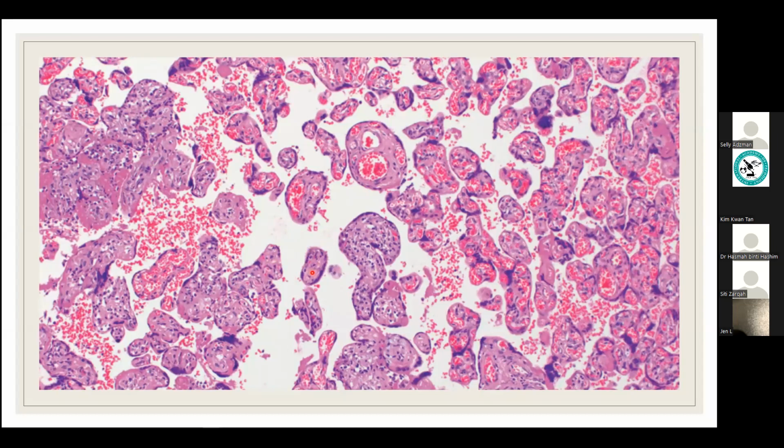But the problem is when we receive fragmented tissue and find only 1 focus, since it was sent in fragments. If there is 1 focus of, say, 15 villi of chronic villitis, it is suspicious of high-grade villitis. Then we need to correlate with the clinical picture, maybe the baby is not well, something like that. Okay, this is the higher power of chronic villitis.